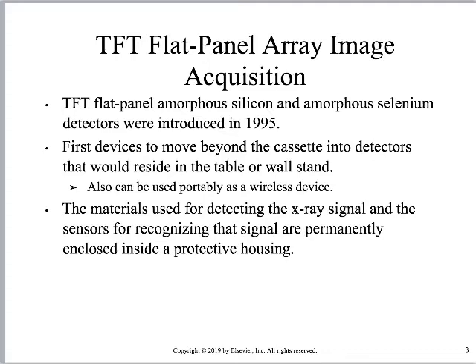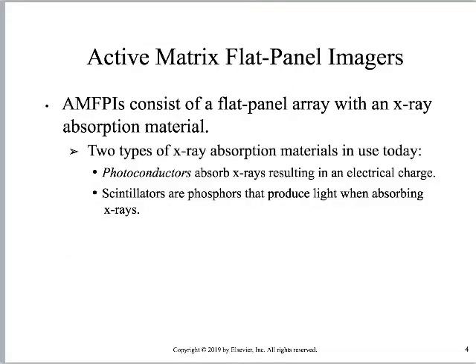So one of the things I'm seeing more and more on Facebook is people posting pictures of an image, and they're saying, I think the detector got dropped, right? I think that the indirect detector got dropped. Is this an artifact related to it being dropped, right? So part of the reason why we need to know in some detail how these systems work is then to see, is this evidence of the detector being damaged, or is there something else going on? Because they are very sensitive systems. And you'd want them to be sensitive systems because they're trying to detect something that's very difficult to detect, right?